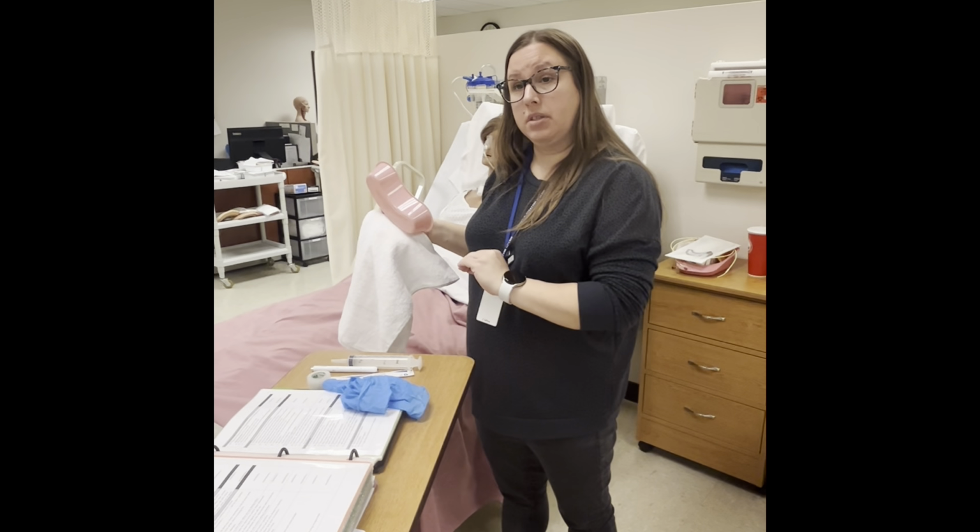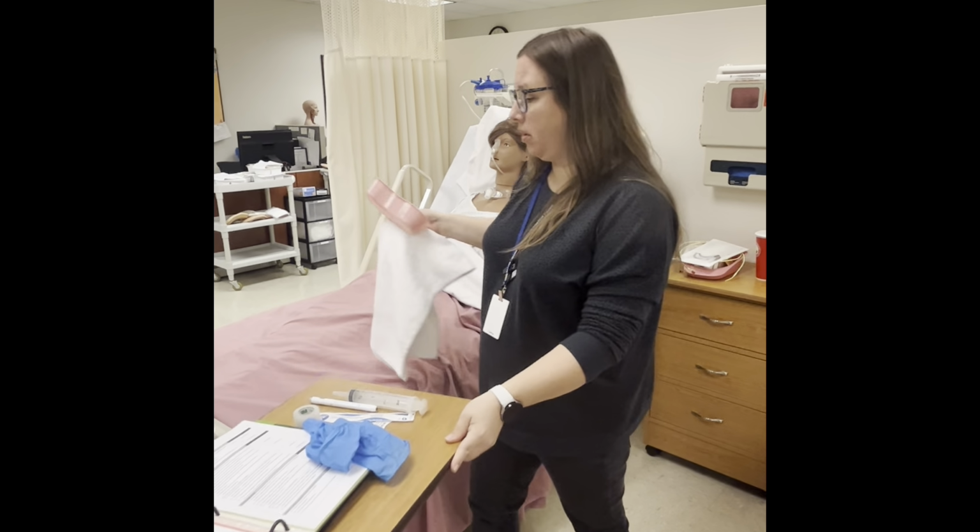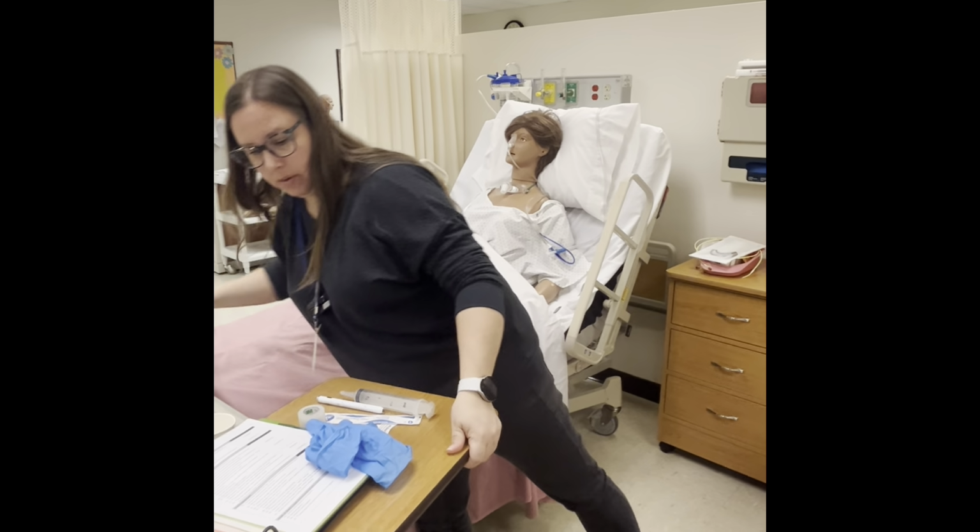clean everything up, and the head cannot go less than 30 degrees. The head goes less than 30 degrees, our patient could aspirate any of those stomach contents or whatever. So that's part 1. Now part 2, we have exactly the same as the other medication ones, because now we have to give them medications.